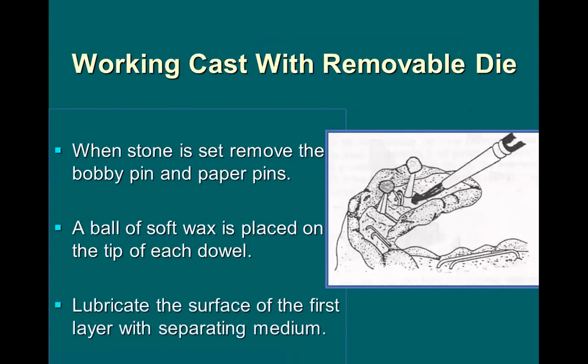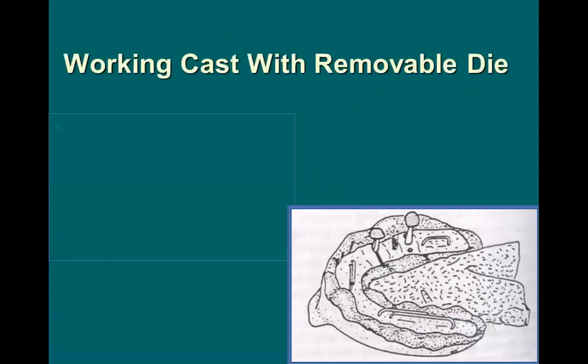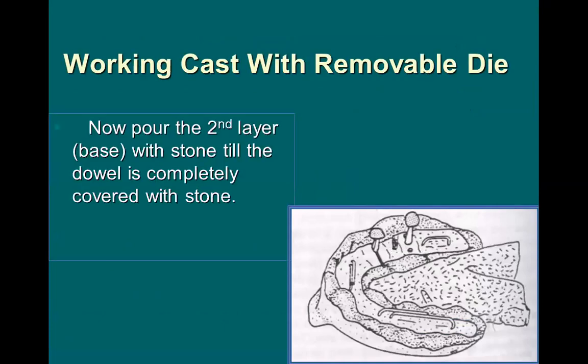After that, we do the second pour, or base of stone, around the impression to make the pour of impression completed.